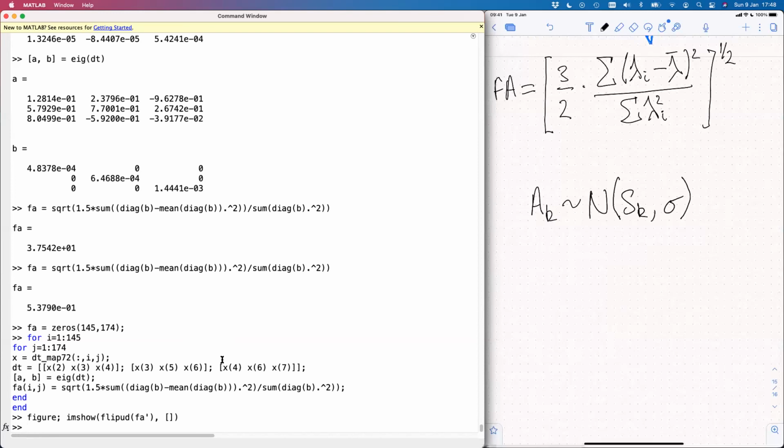So I'm saying then a Gaussian noise model for the diffusion-weighted MRI signal, where the standard deviation is the same for every measurement. It's not perfect, but it's not an unreasonable model for that data, which would suggest then that standard linear least squares is a reasonable way to estimate the diffusion tensor.